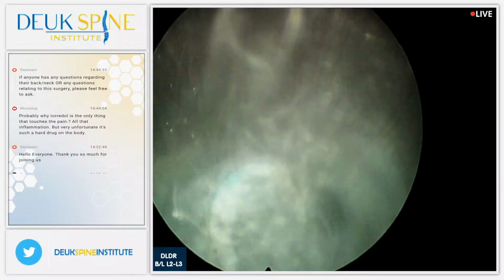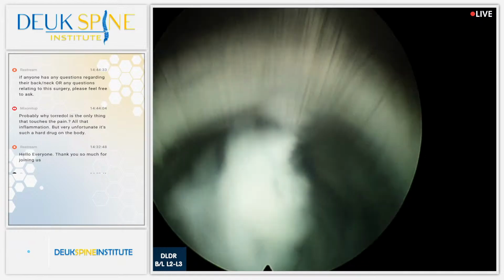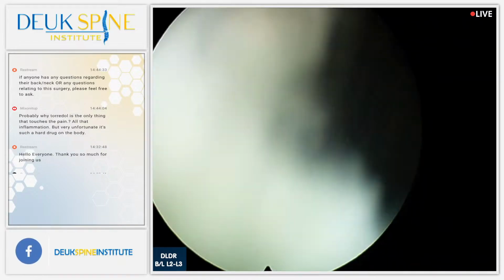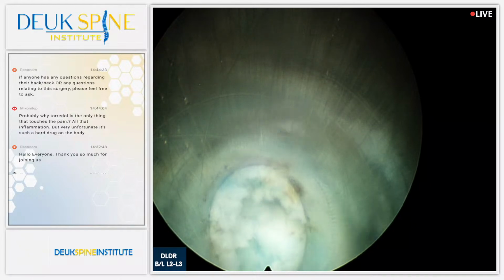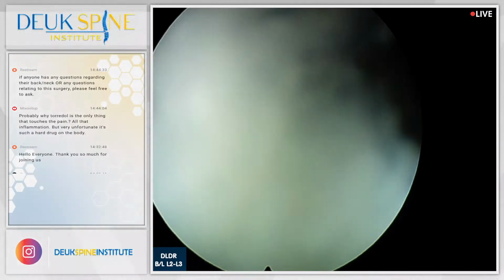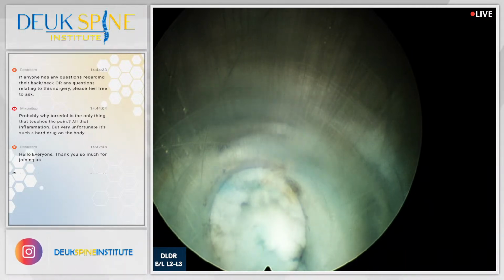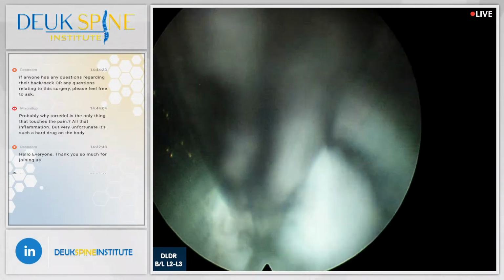Welcome back. You can see now with that video that what we're doing with our laser and endoscope is we're identifying where the tear is, and we're using the laser to remove pieces of herniation out of the tear, and cleaning the inflammation, cleaning the herniation, cleaning the bone spurs if there are any that we need to take out, cleaning up the painful tissue.